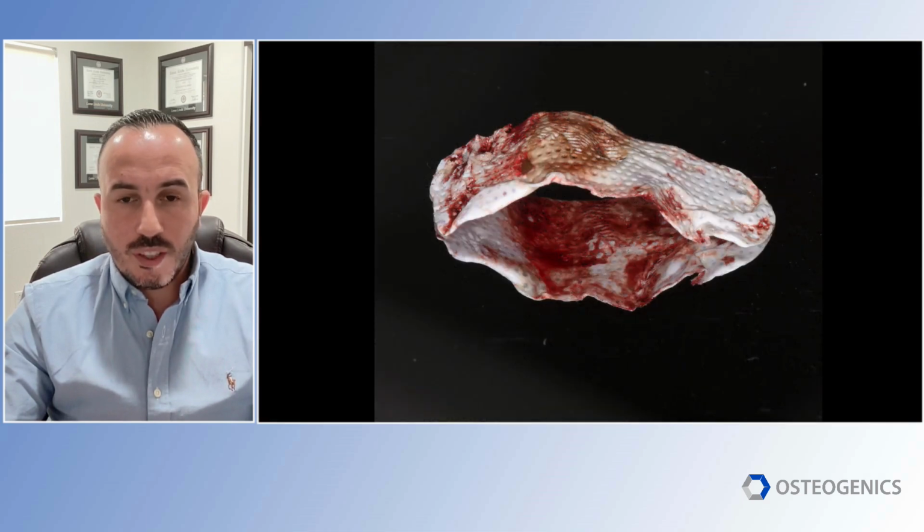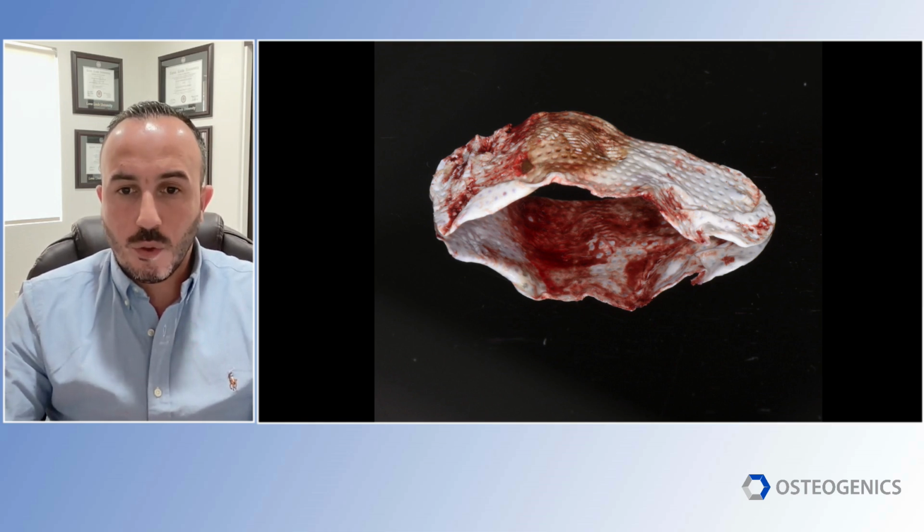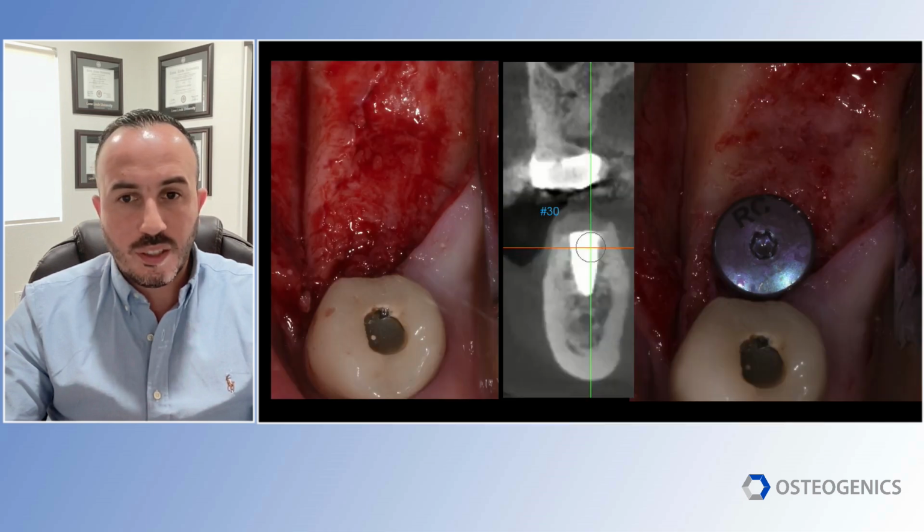And this is the membrane. You can see the sides that are tucked in. They're white, they're clean. The side facing the oral cavity is not clean. And if you look, it's a mirror image. If you look on the interior surface, it is clean. There's no bacteria or any discoloration.